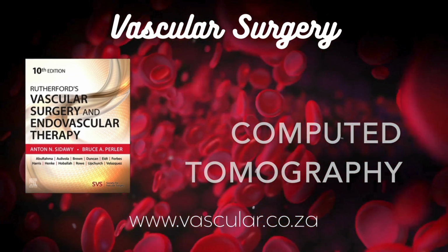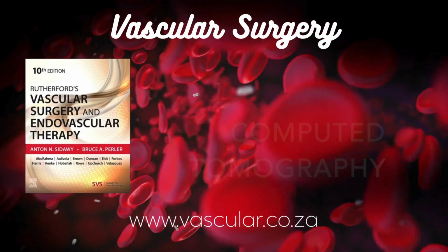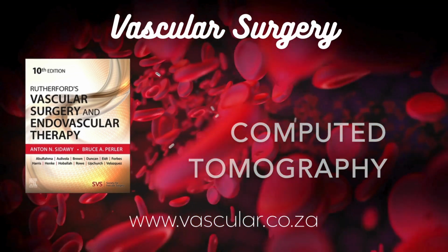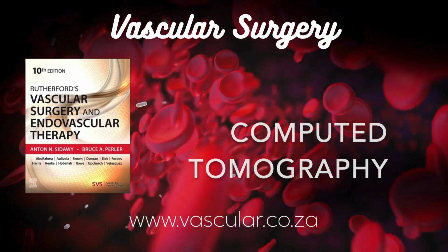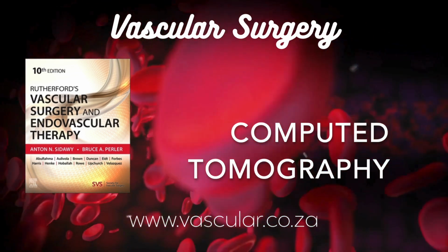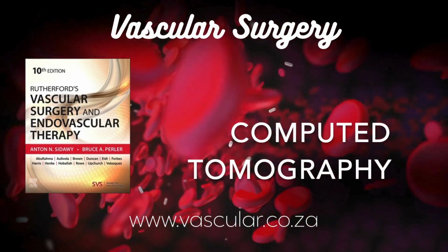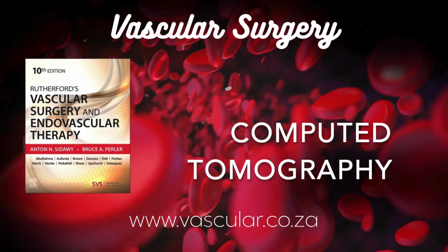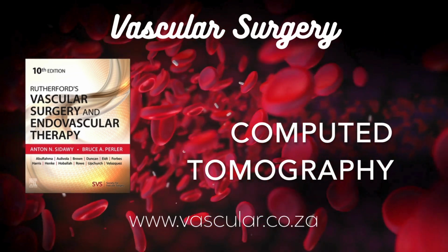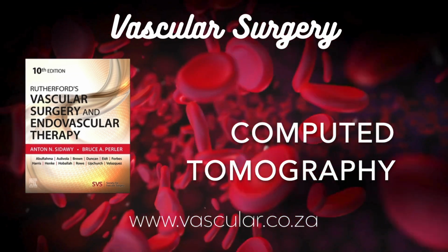How did iterative reconstruction, IR, change things? IR became feasible as computers got much, much faster. It's a totally different approach. Instead of a direct calculation, it starts with an initial guess of the image, and then it simulates the scanning process, compares the simulated data to the actual raw data that was measured, figures out the difference, the error, and then adjusts the image guess to reduce that error. And it does this over and over. Exactly. It iterates, refining the image step by step. Crucially, it can incorporate sophisticated models of the scanner physics, the X-ray beam characteristics, and even the statistical nature of noise itself. What's the benefit?